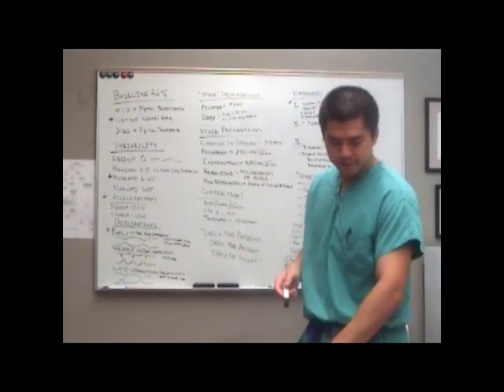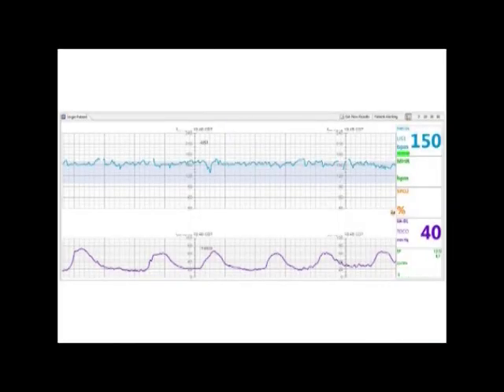Now, is it indicated to do an amnioinfusion for a thick meconium or recurrent lates? No. Okay. For this example of fetal heart tracing, what category would you describe this as?